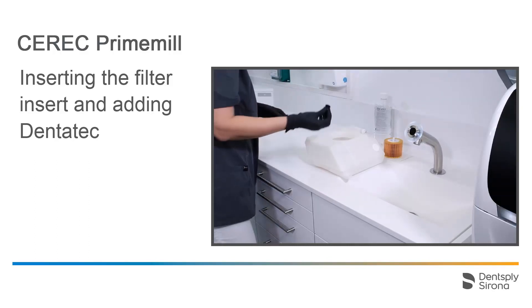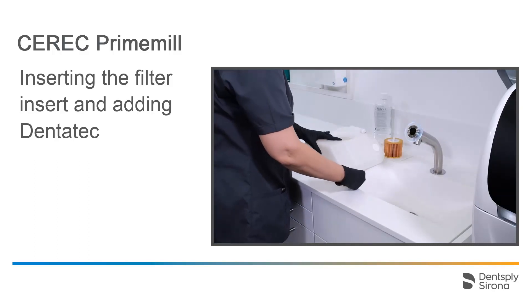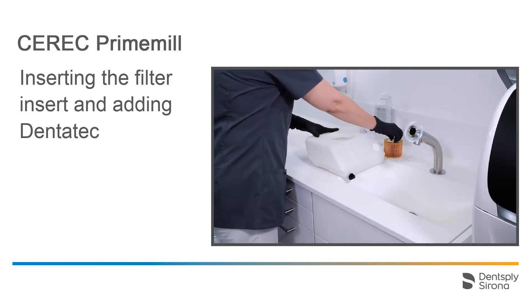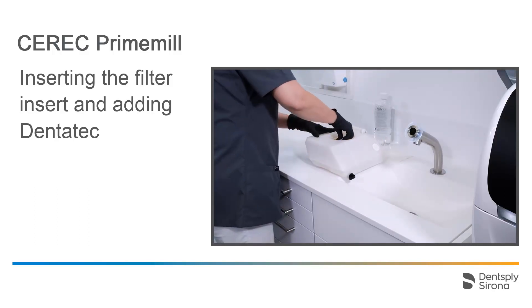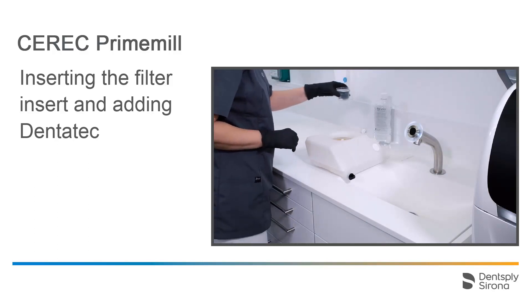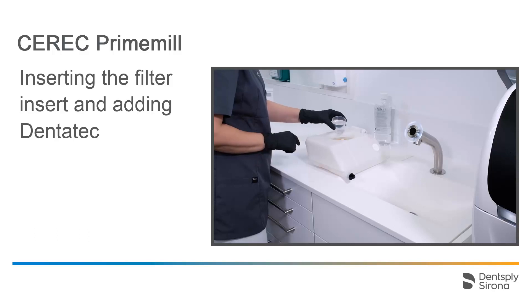Then we close the drain again, place a new filter insert, and distribute 75 milliliters of Dentatec, a coolant additive, evenly over the filter.